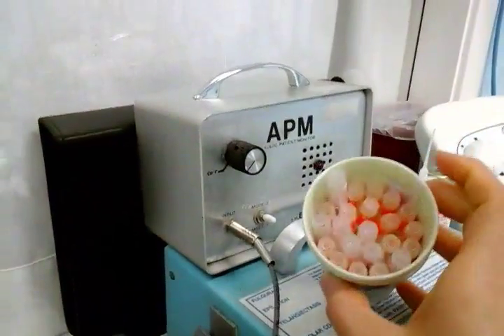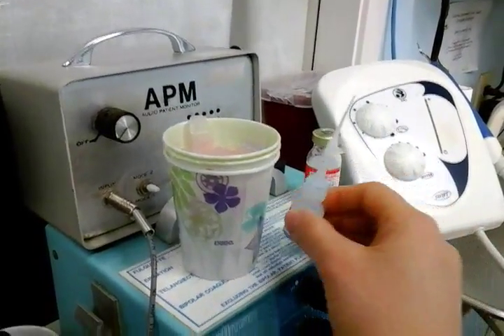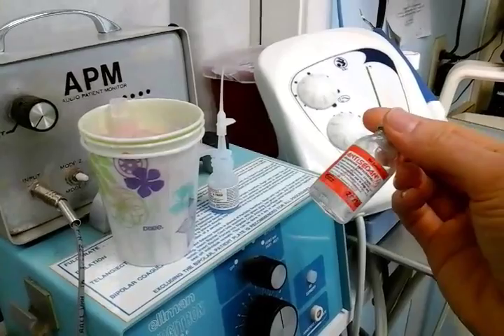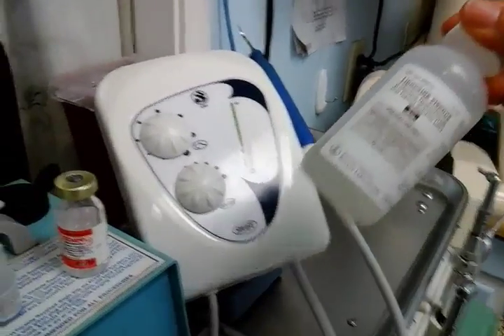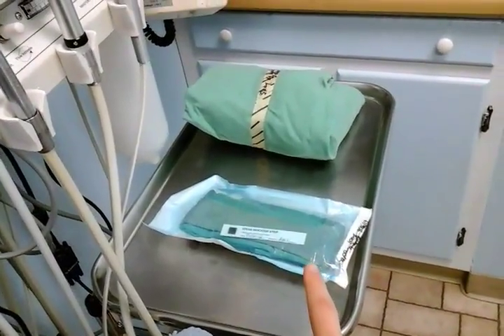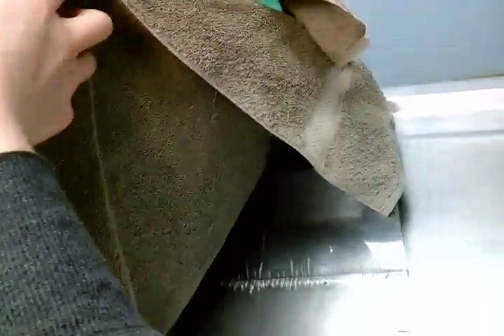Then out of the drawers over there, we will pull out our cup of needles, our surgical glue with a fresh cap on the top of it, antisedan for our feline patients to wake up, and lidocaine gel for the gag reflex on our cat patients. Then we will pick out an appropriately sized surgical drape and pack for whatever we're starting with. If it is a spay of some sort, we get a V-tray, small, medium, or large.